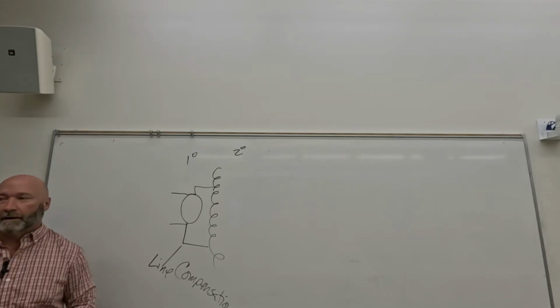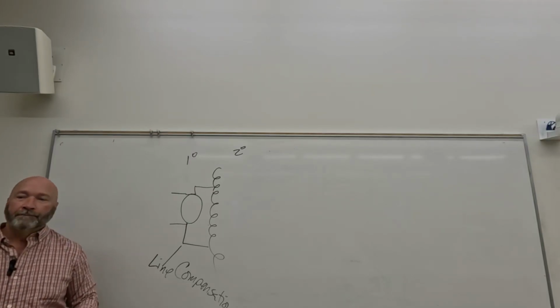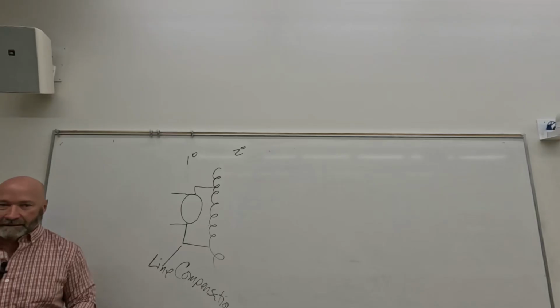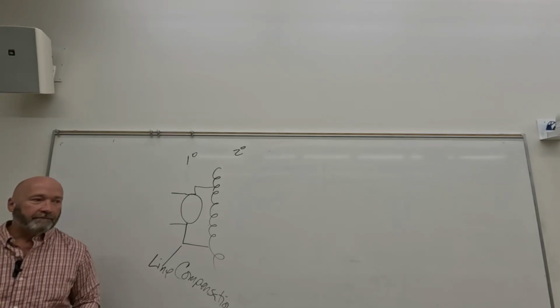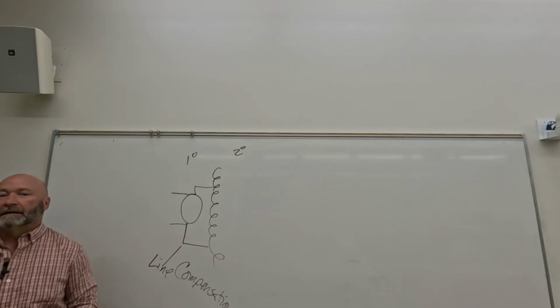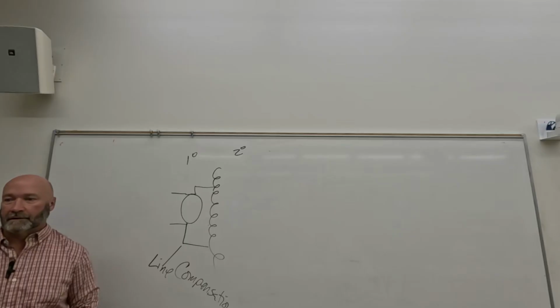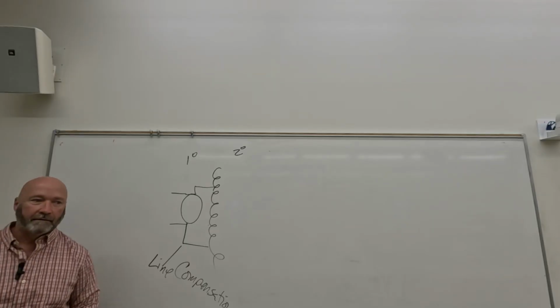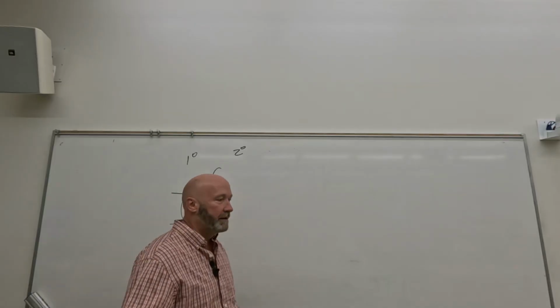I don't know that I've ever worked with a machine that shot as low as 25 kVp. 40 is usually the basement that I would see. And it says you can shoot with up to 150, and I have worked with some of those, but you never use that. The highest kVp typically that you're going to use is 110, 120 kVp, but you could go above that. So that's the range, 25 to 150.